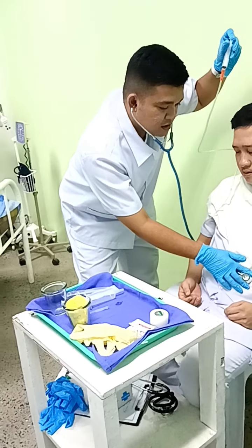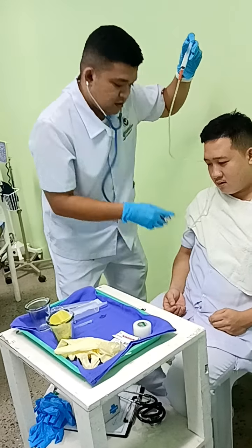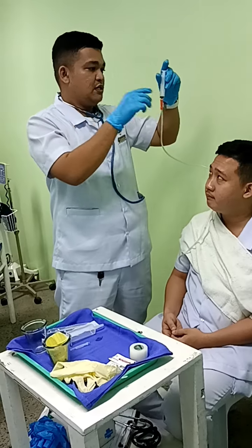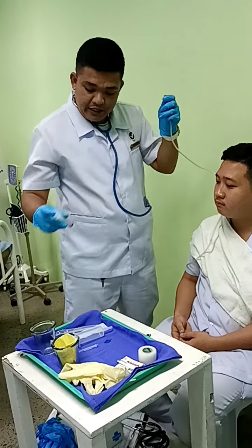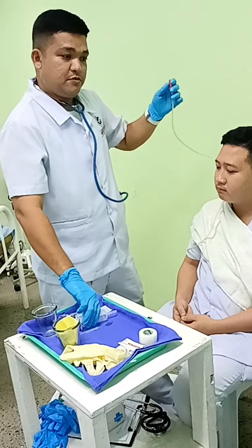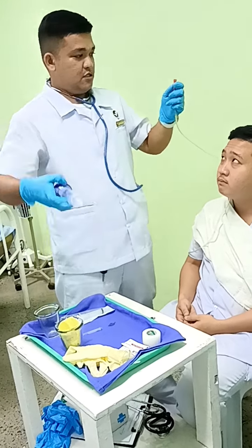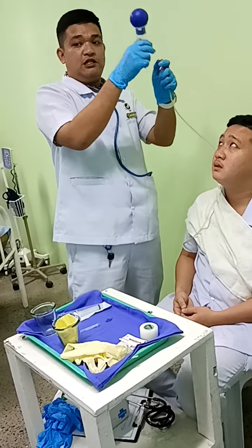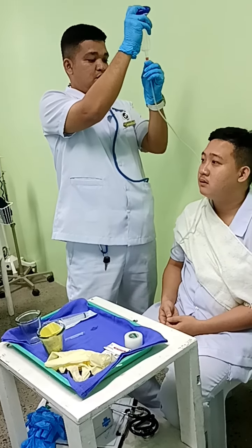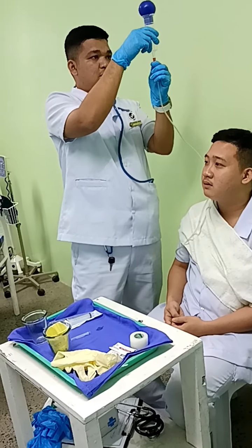Right. So for enteral feeding, we're going to assess the patient for the need for enteral feeding. Next is to auscultate the patient for bowel sound, and then aspirate gastric contents. So insert the suction. And then auscultate the patient for bowel sound.